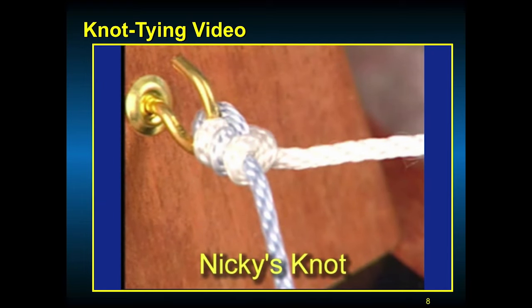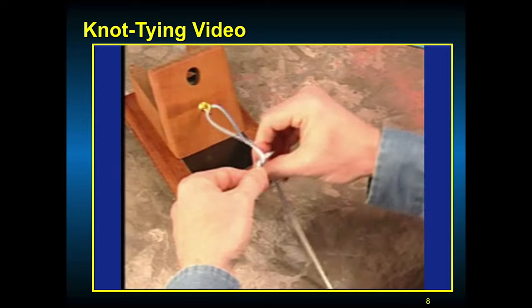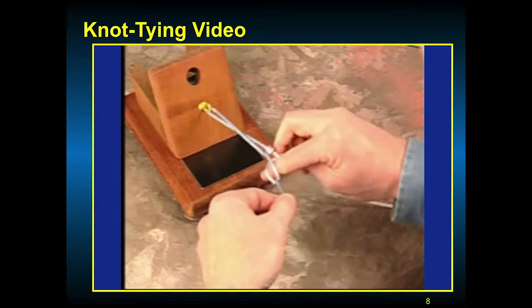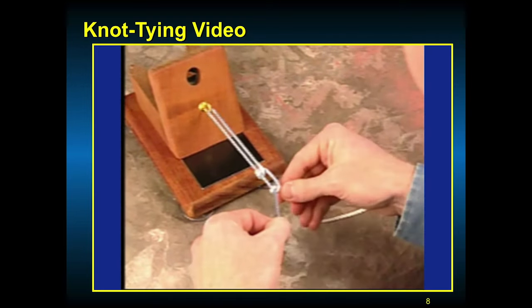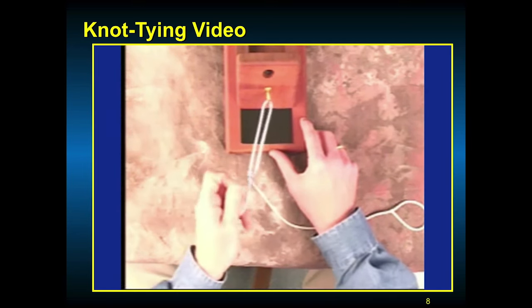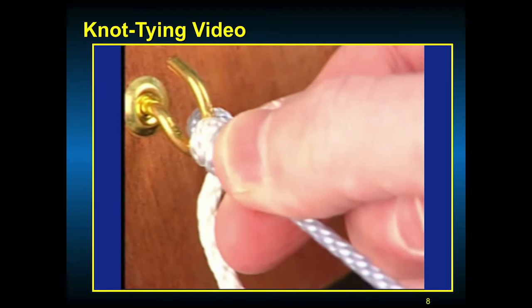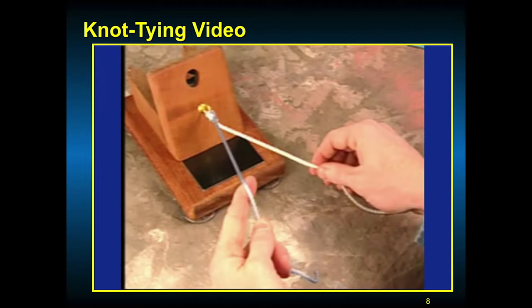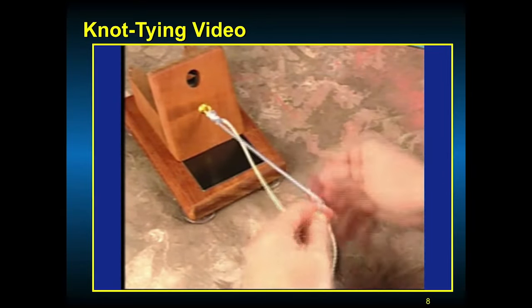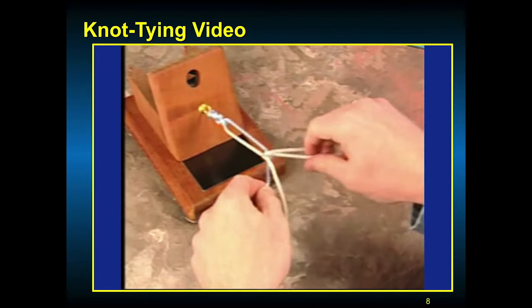This is a demonstration of Nicky's knot, a modified taut line hitch. The post limb is one half the length of the loop limb. An initial overhand throw is placed, followed by another overhand throw. A final overhand throw is then placed behind the first two. This is lightly secured on your post limb, and with back tensioning the knot is slid into the joint, securing the tissues. The knot pusher assists in pushing this knot into the joint. While maintaining tension, an underhand throw is placed on your post limb. You then alternate posts, doing an overhand throw on the new post limb and a final underhand throw, thus securing the knot.